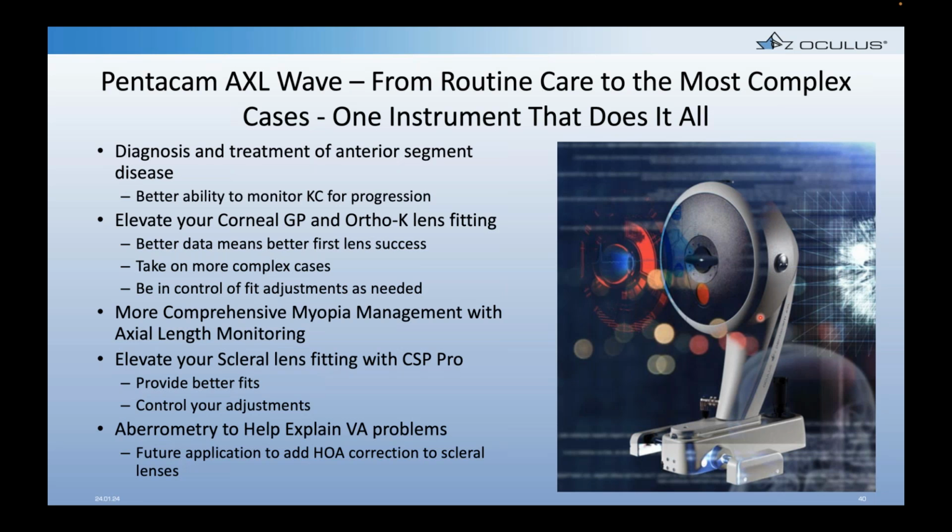Diagnosis and treatment of anterior segment disease, as we mentioned, elevating your contact lens fitting skills, your abilities to take on more difficult cases, to be more efficient when you're fitting a patient, and again, to be able to explain to the patient, I'm making you a custom lens that's made specifically for the shape of your eye. And when that lens comes in and it works at a very high rate the first time, it's very impressive to patients. And so it saves chair time, it makes you more efficient.